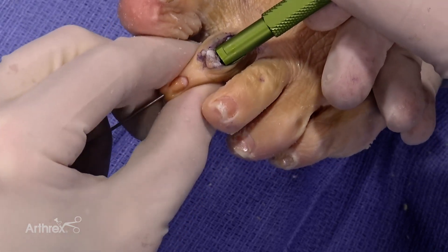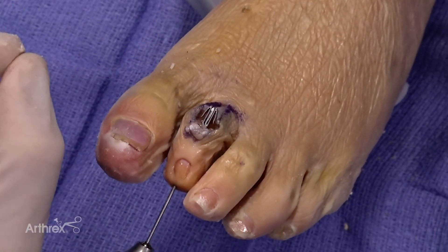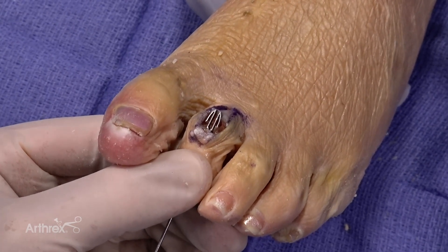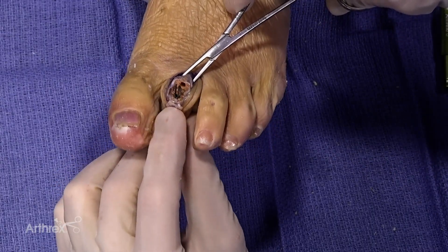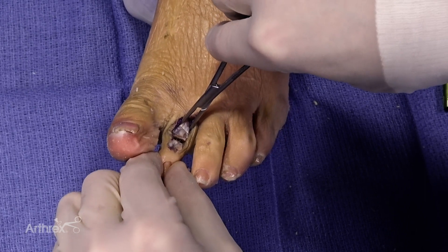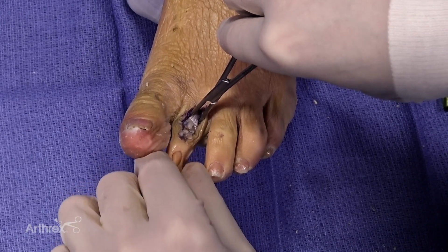So there's the flat spot. I'm going to bring it back just a little bit more, then we take this off. As you can see, the guide wire is bringing the barbs apart, so we're going to back up the guide wire to allow the barbs to come together for insertion, and then we have the option of advancing it back if so desired. At this point, I like to hold the shaft of the proximal phalanx using an instrument, and with the guide wire retracted, the barbs can come together and be inserted. Then you have the option of advancing the guide wire back and springing apart the barbs within the bone.